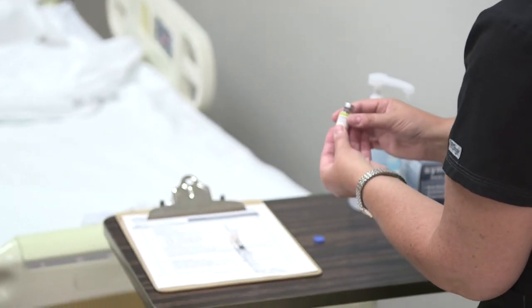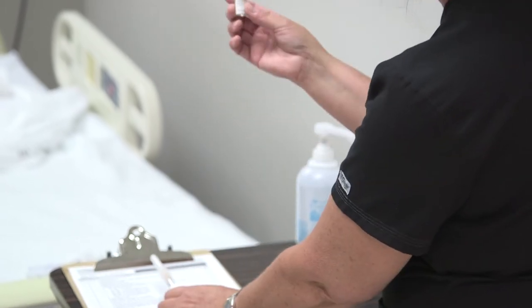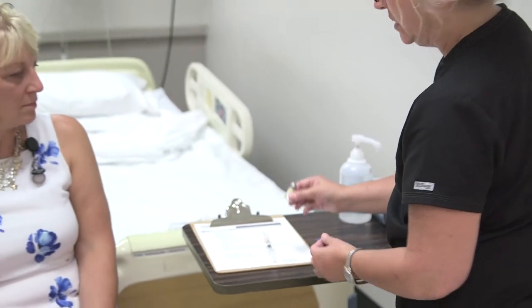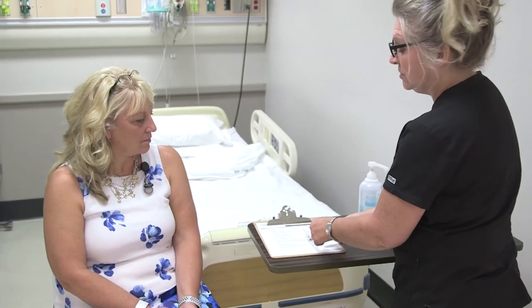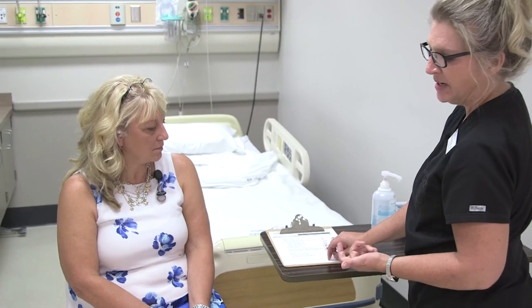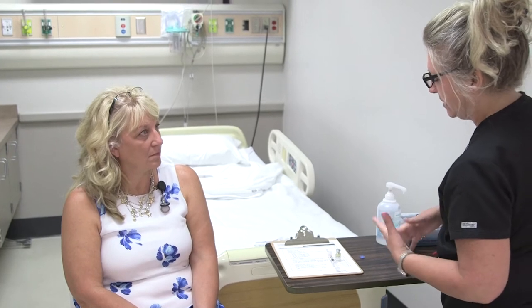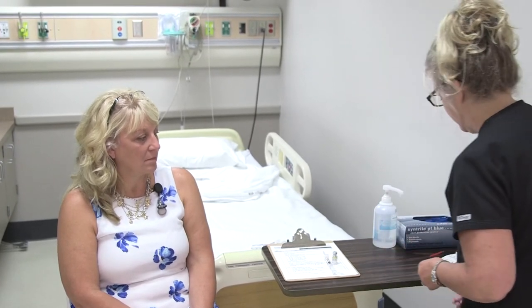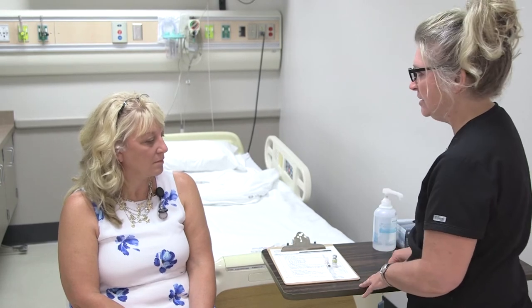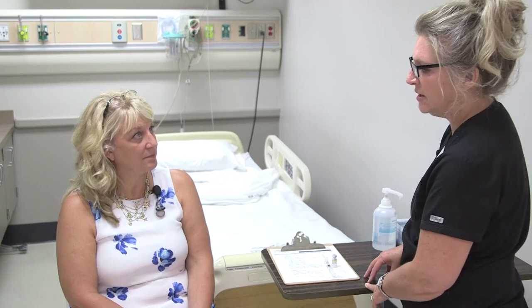Make sure when you're doing your checks now, you have the dose drawn up and you'll need the vial with you as well while you start your 3 checks so that we know what medication we have. And also you would want to label your syringe with the medication, dose, patient, the amount of fluid, and your initials, just because that's best practice to label it. All right, so now when I'm ready to go into the patient's room, I will proceed to do that after I do my first 2 checks.